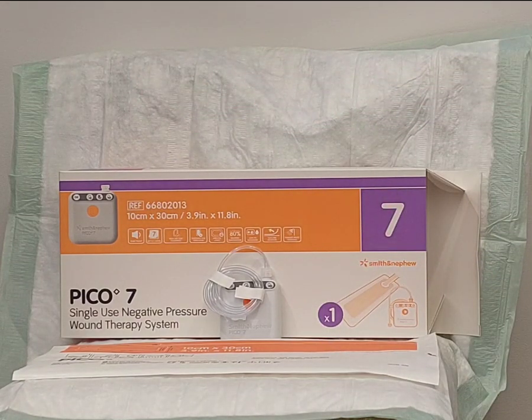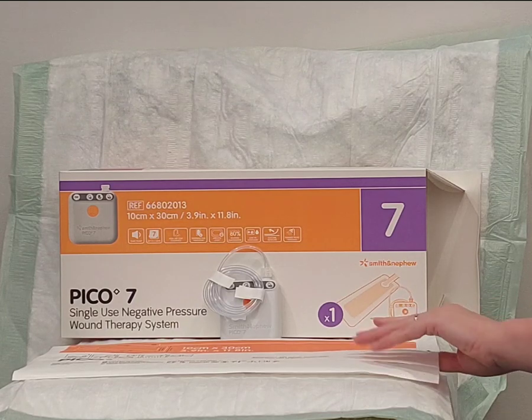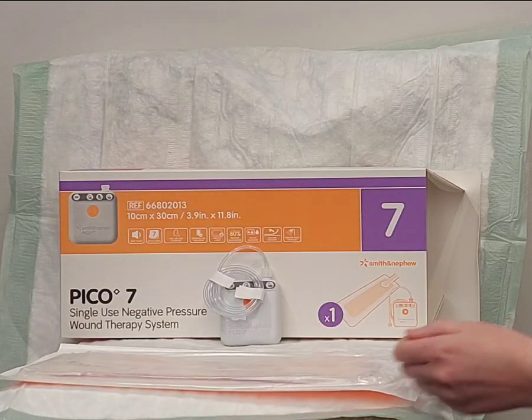They're suitable for use in open wounds that are shallow, so less than 0.5 centimeters deep, but can also be used in deeper wounds with a gauze or foam filler. In ICU, we most commonly see them used on closed sternotomy wounds following cardiac surgery.